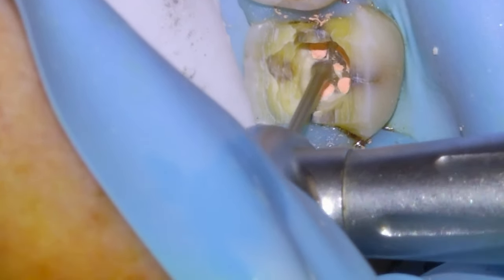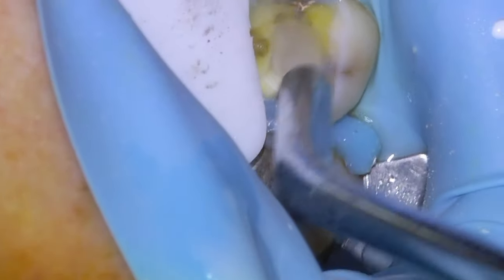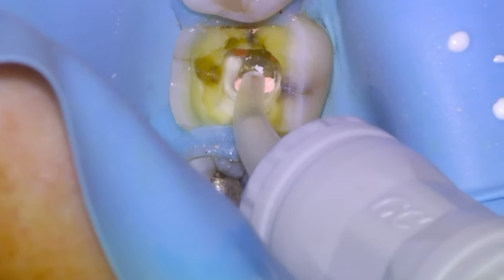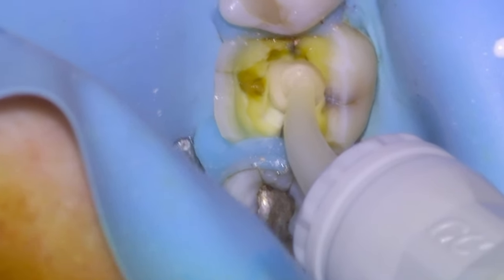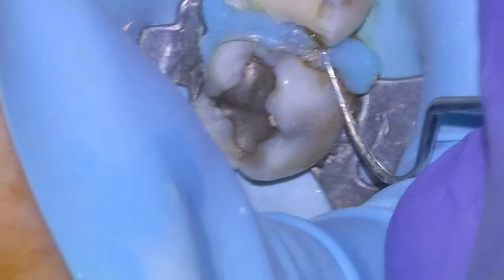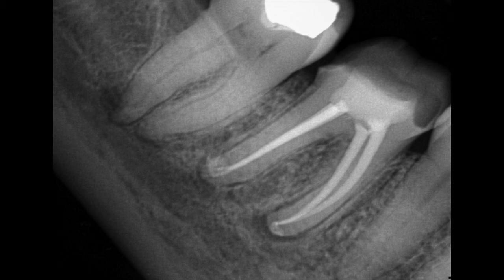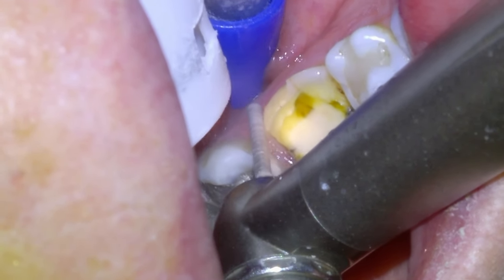I'm going to remove a little bit of the excess GP just to make it look nice. Then we'll bond a core — Equia Forte is indicated for use as a core and it works great in my experience, so that's what we're going to use. Five-second phosphoric acid etch and rinse, mostly dry it, and then apply the Equia Forte material. It's a time-set so we wait four minutes, then come back and disassemble the rubber dam, removing the liquid dam. There's the final — we're happy with the little bit of extrusion out the apexes, and then we're going to do a crown prep.